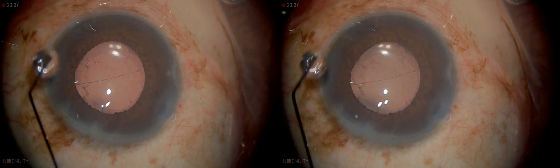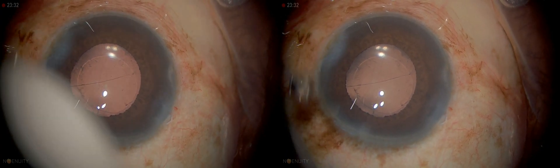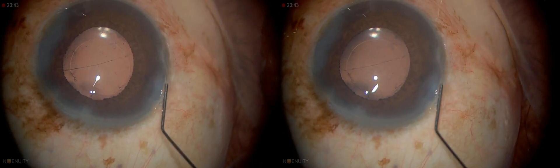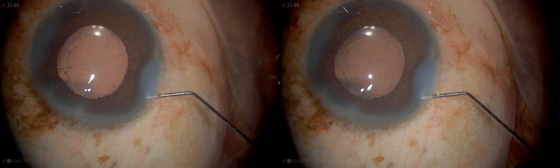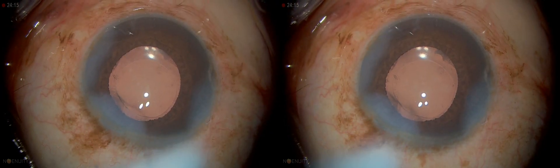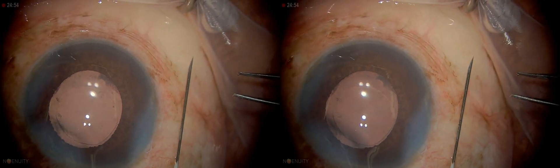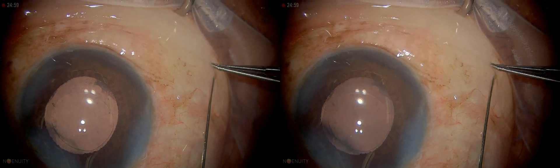For this case, we want to first hydrate the paracentesis we created. See how tangential I am doing my wound hydration? Have it pointing directly into the stroma — you get much better hydration. Now we're going to check our wound. We don't want the needle ever pointing at the eyeball. Point it, line it up like this — inject below.